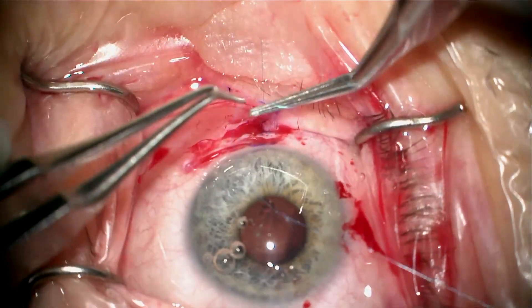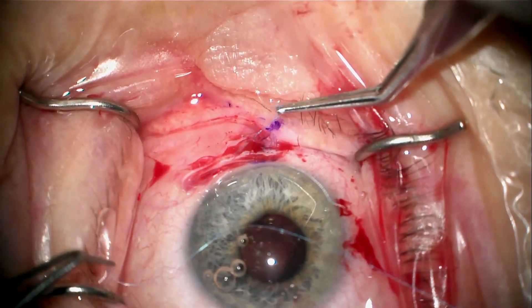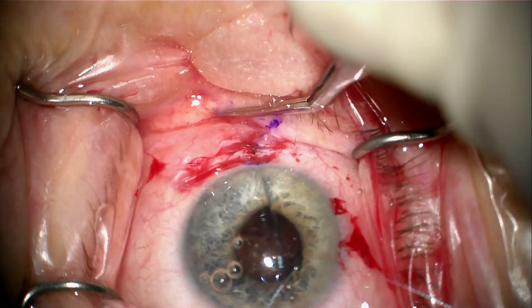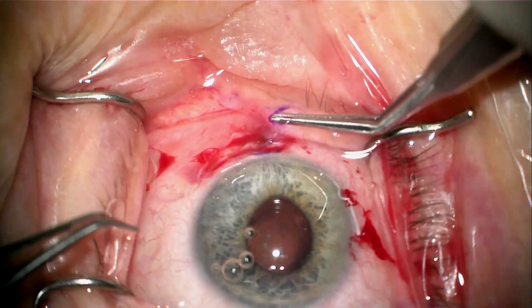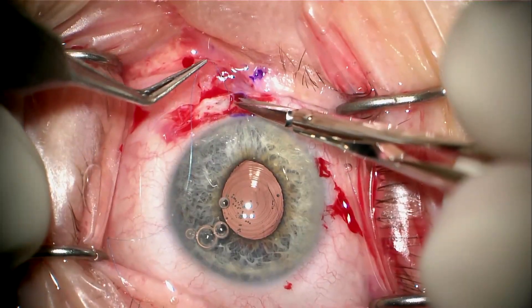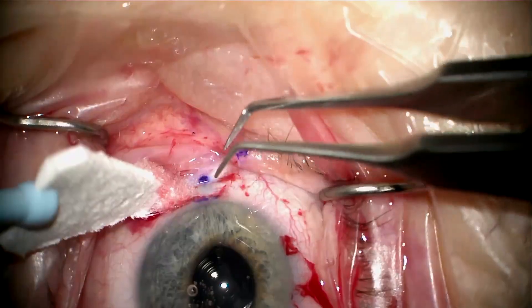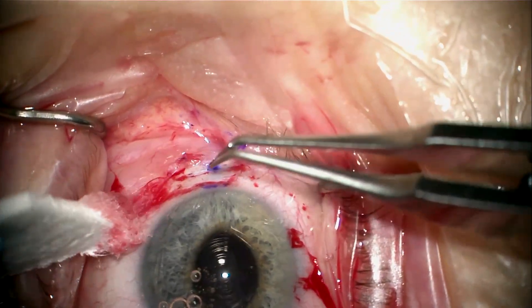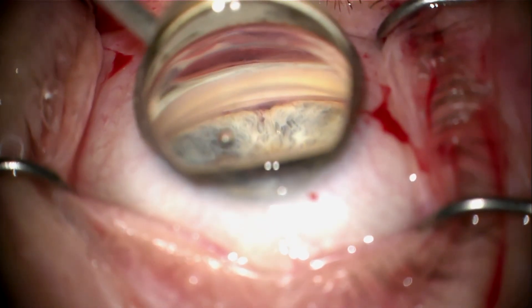One end is cut short. I'm going to do a 3-1-1 tie and tie this very tight. When I do this, I can see some very slight ovalization of the pupil, as you see here. I'm going to cut the knot short after the 3-1-1 tie and then bury the knot by rotating it into sclera, as you see here. We're then going to inspect again with gonioscopy and confirm that the cleft now is completely closed.